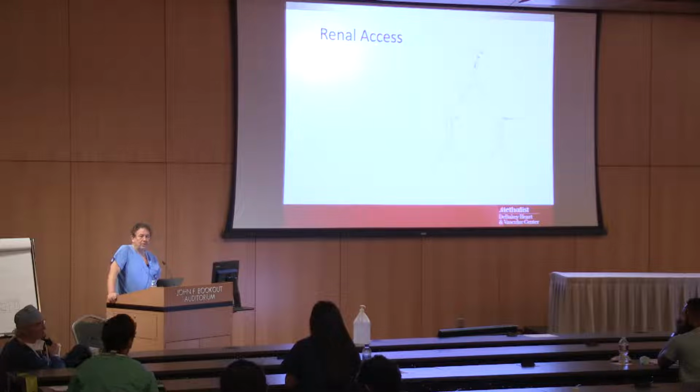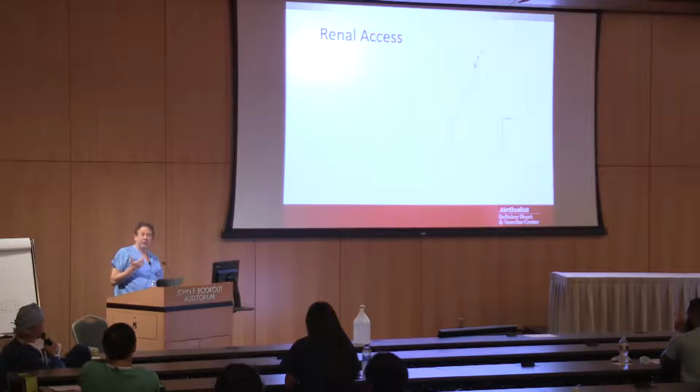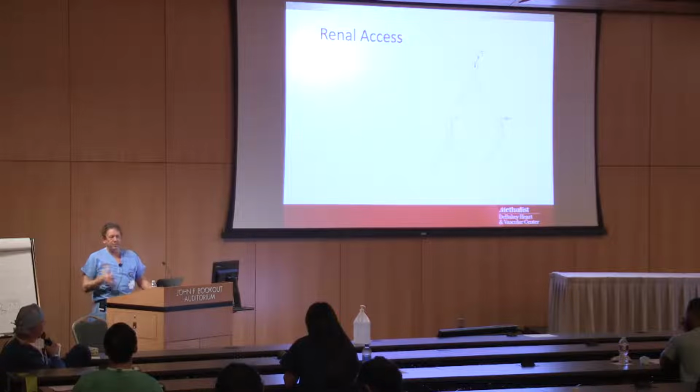Flush a little bit. Flush with what? Heparinized saline? No, contrast. Okay, we're going to put a little dye in there. So you hand inject, okay? You're not going to basically go to the tech, hey, hook it up, 10 for 10, power it into that renal artery. You're right. You're going to hand inject. You don't even need DSA at this point in time because you will see that the renal artery is flushing. And so you have to take the wire out in order to do that. Okay, then you've got to put the wire back in.